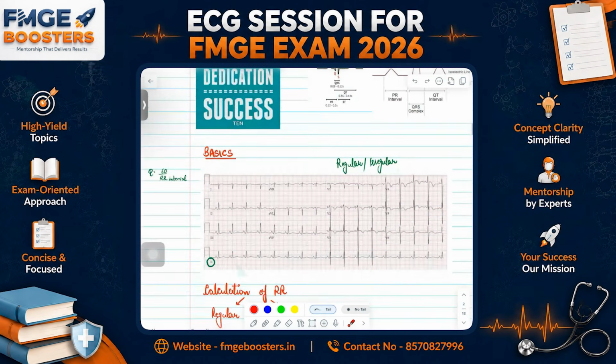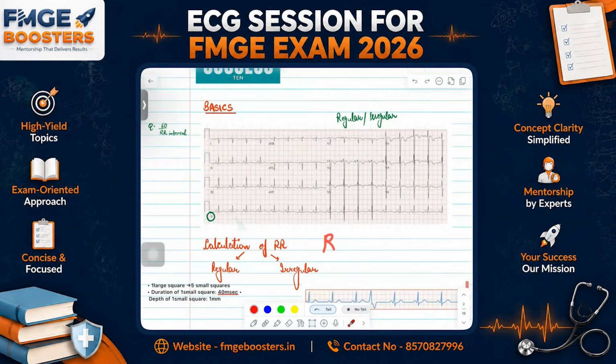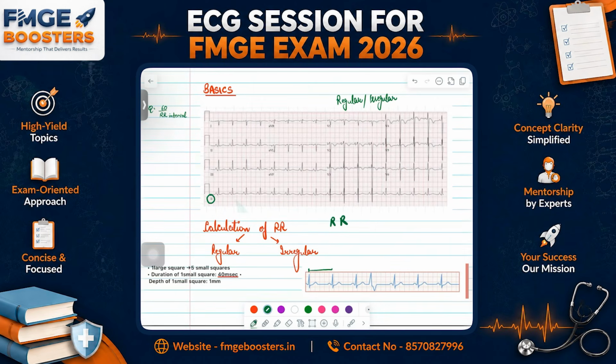We will see the RR interval, from one R to another R. If the RR interval is equal to the second RR interval, it means it is regular. But if the RR interval is not equal to the other RR, it means irregular. First concept is clear, guys. When an ECG is coming in front of you, the very first thing you have to see is regular or irregular.